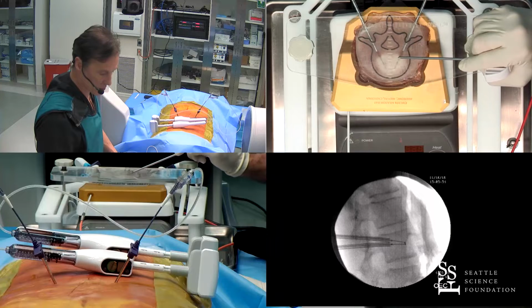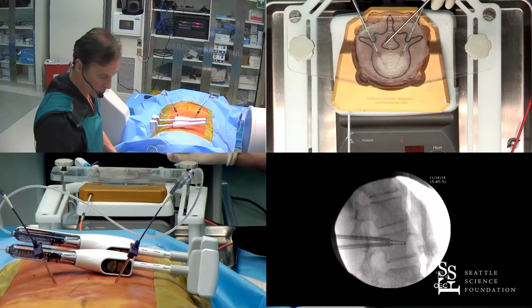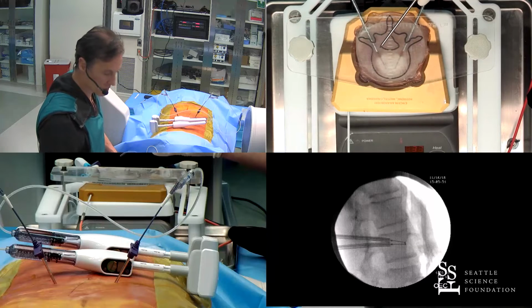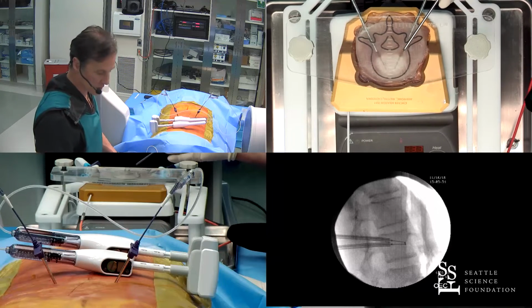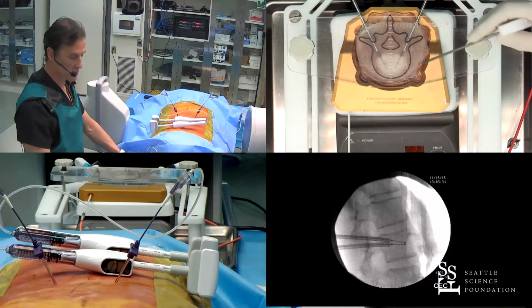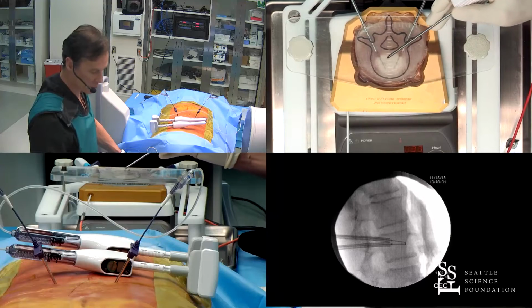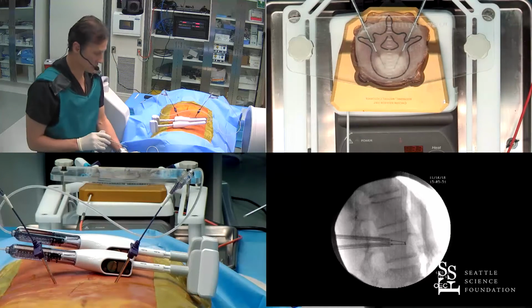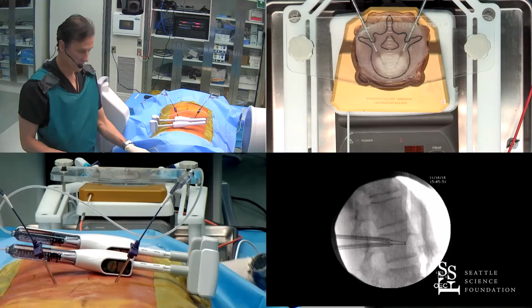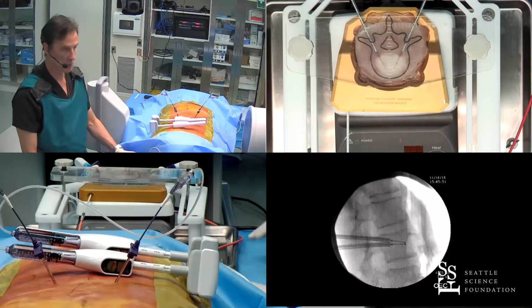It provides a burn elliptically around the needle on both sides, but what you'll see is with two needles in place, using a bilateral transpedicular approach, you get this nice big oval of ablation. The ablation zone mimics the shape of a vertebral body, the tuna can shape of the vertebral body. So each independent ablation zone and then an amalgam will ablate tumor thermally.